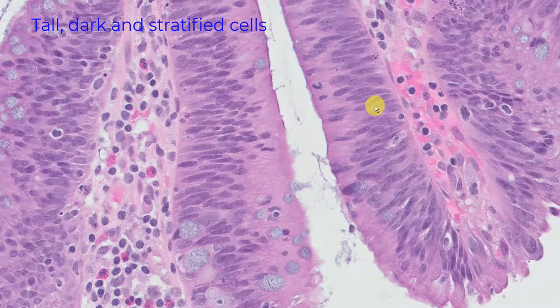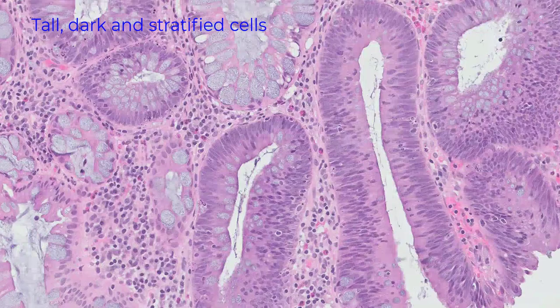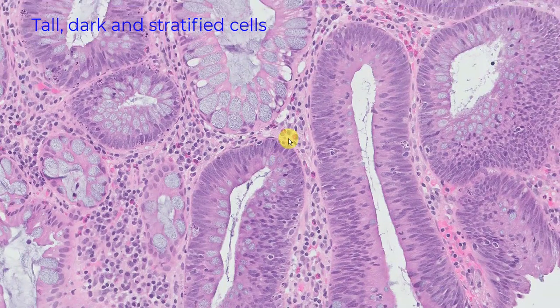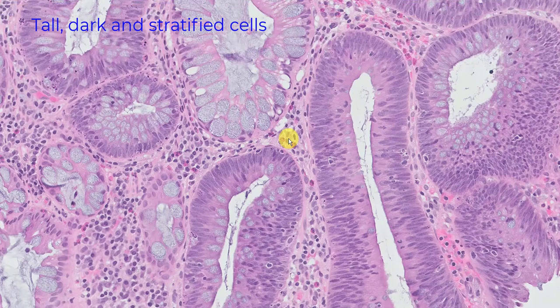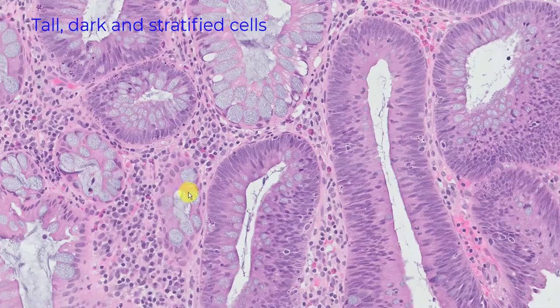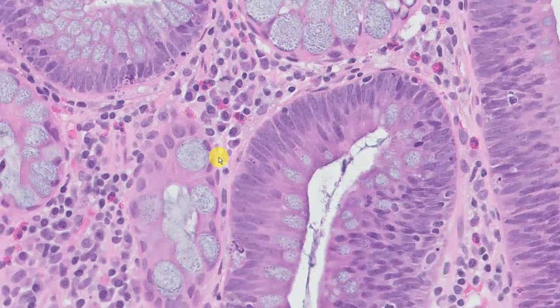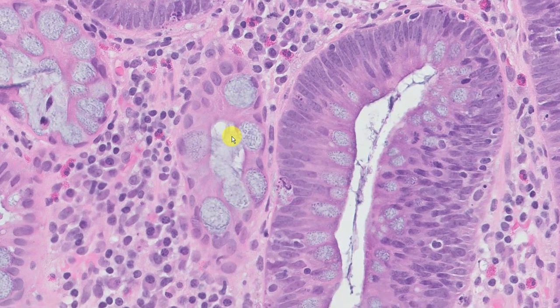Here, here, and here the cells look tall, dark, and hyperchromatic. But you have to ask yourself: tall, dark, and hyperchromatic compared to who? And the answer is tall, dark, and hyperchromatic compared to adjacent normal colonic crypts. And I promise you, you will see normal colonic crypts.